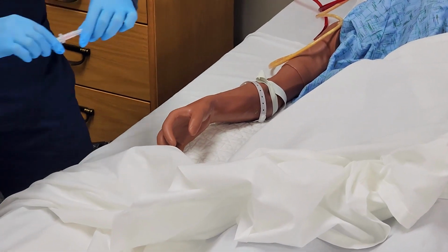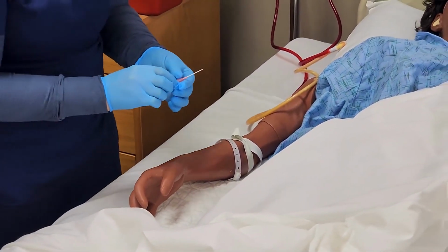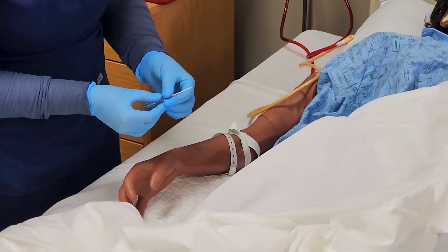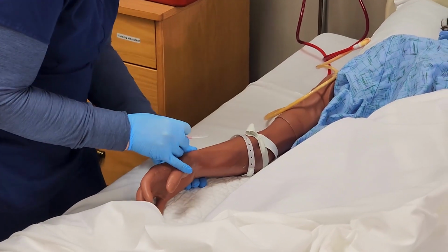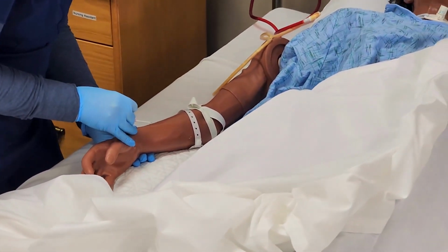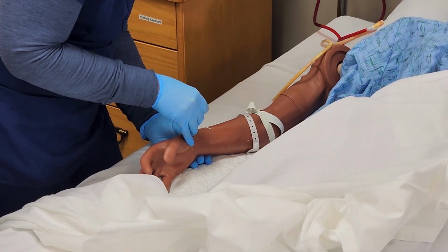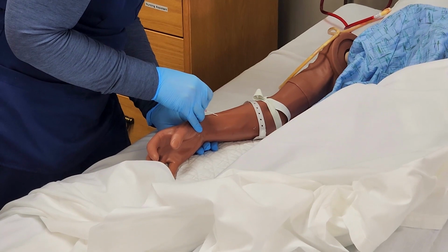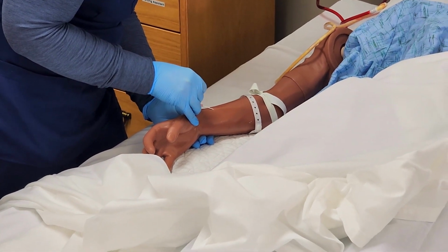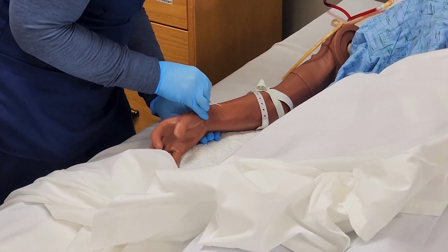And I'm going to remove the protective cover on my IV. Okay, make sure that my bevel is up. And then I prepare the patient and tell them I'm going to puncture the skin at about a 5 to 15 degree angle. You're going to feel a poke. Once you feel that puncture the skin, go in a little bit more and try to even out your catheter.